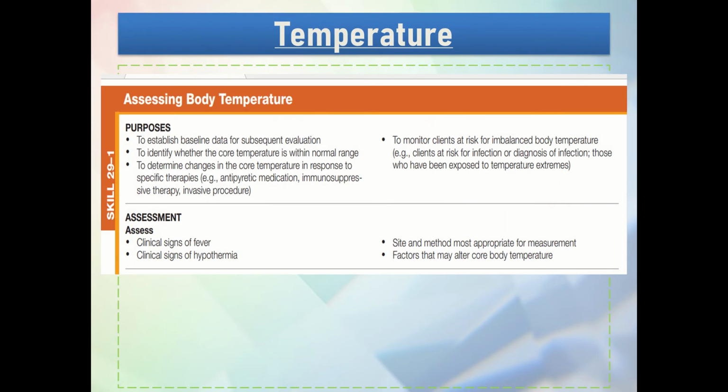And then I just included here yung skills or yung checklist in getting the temperature. Later, I will discuss to you yung checklist na gagamitin natin. Kasi sa checklist na gagamitin natin, we are just going to use one checklist for getting all the vital signs. In this case kasi, one checklist for each vital sign.